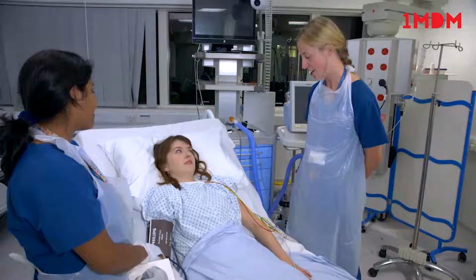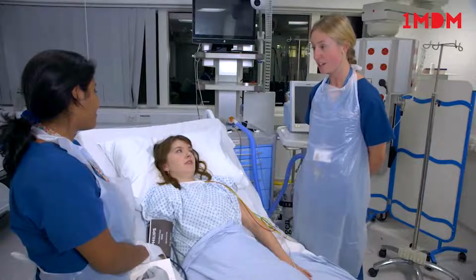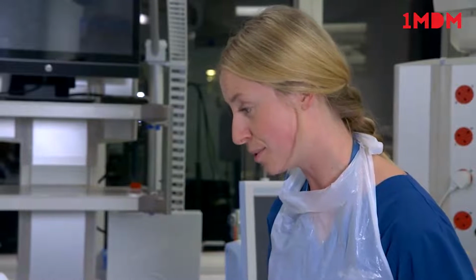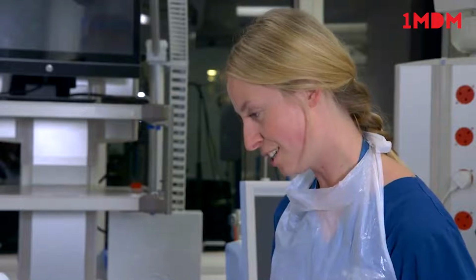Before fitting, you should provide careful explanation of what you are about to do. Firstly, introduce yourself to the patient. Explain to them that you are going to fit a tight-fitting mask onto their face. We're going to size up a new mask for you today, which is going to help you with your breathing. So if it's okay, Diana will size that up for me, and then we'll get going with the machine.